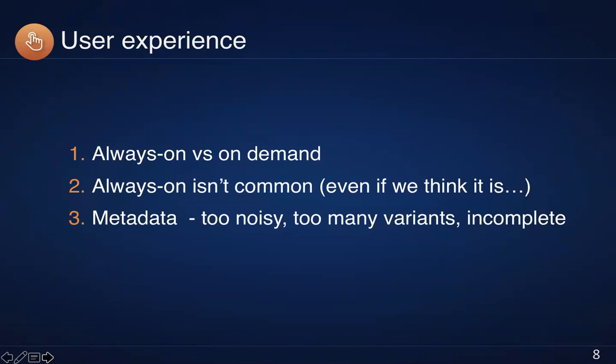Similar to reports, where you would definitely want to have a machine understand exactly what findings are mentioned in the report, because they're written in free text, you cannot extract those insights easily. Similarly, the metadata isn't easily extractable. So our takeaway from here was that either we have to choose a very narrow use case.